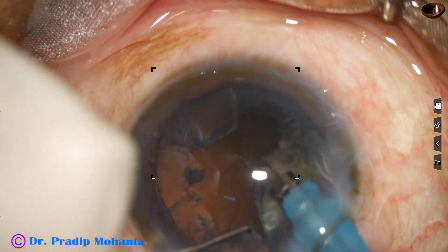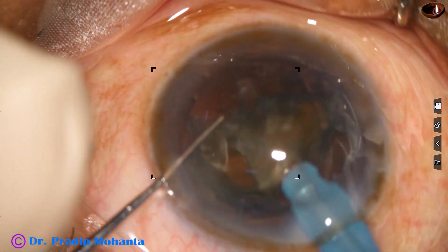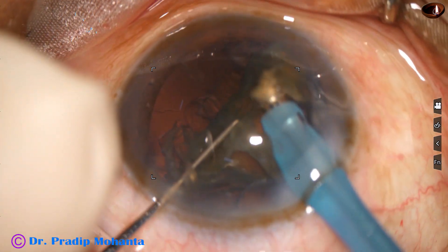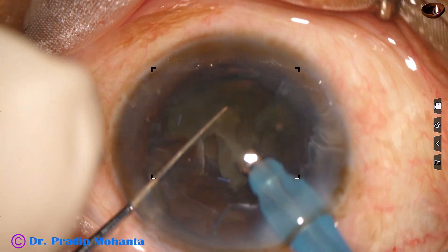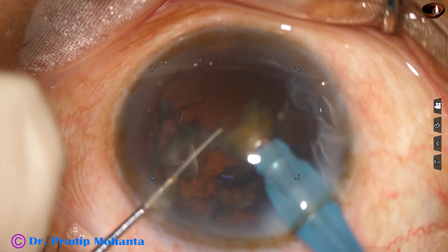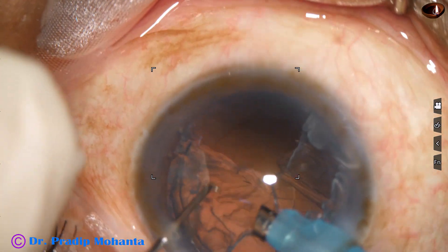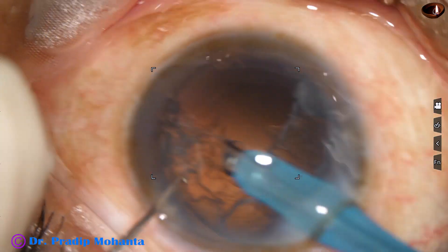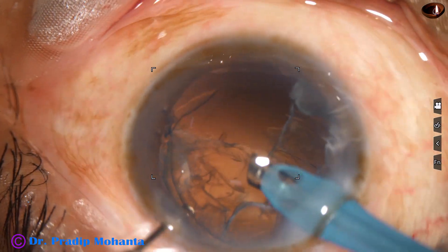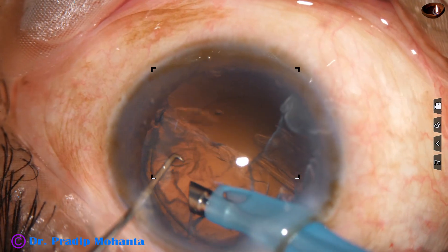This is the last nuclear fragment. We can either reduce the parameters to be on the safer side, or we can control the foot switch with caution and manage the last piece.